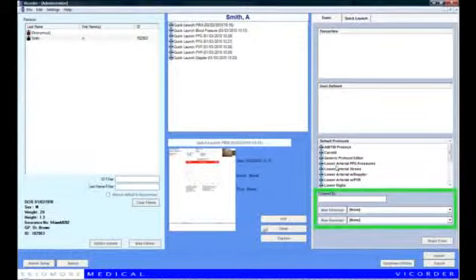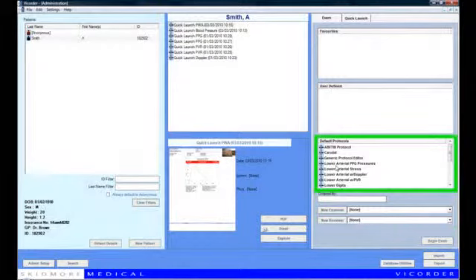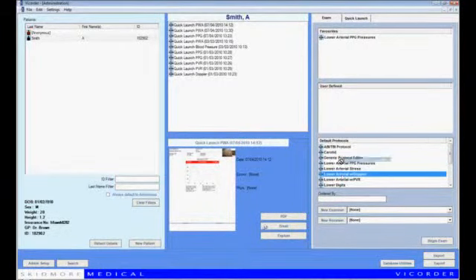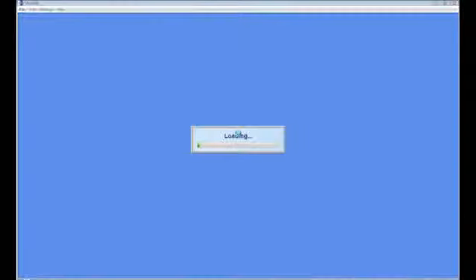We will now look in more detail at the panel that contains the supplied protocols. At the bottom of this panel are some text boxes where details such as the examiner and reviewer may be specified. The next box up contains the various protocols that have been supplied with the package. If any of these protocols are regularly used, they can be dragged and dropped into the top panel, the Favorites panel, for easy access. Once we have selected and launched one of the standard protocols, it may be edited in order to generate a user-defined protocol.